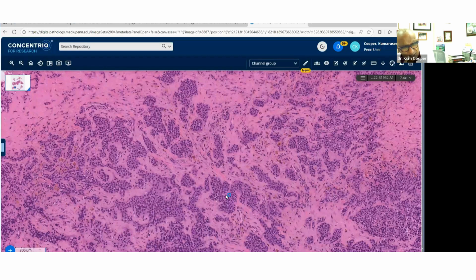So keep beta-catenin. Remember, it has to be a nuclear stain because the beta-catenin is transferred because of the mutation from the membrane through to the nucleus. And so it has to be nuclear, like in solid pseudopapillary tumors of the pancreas as well. So even in fibromatosis, you're always looking for nuclear stain for beta-catenin.